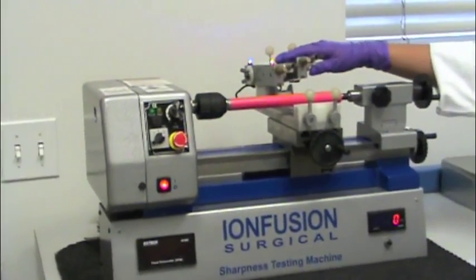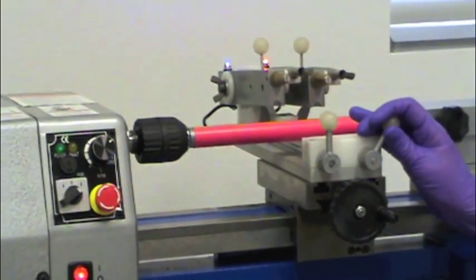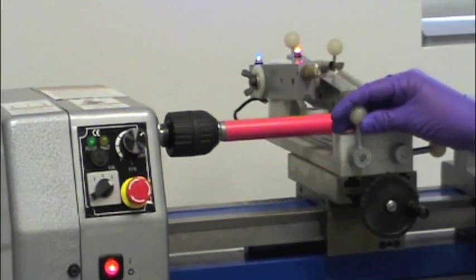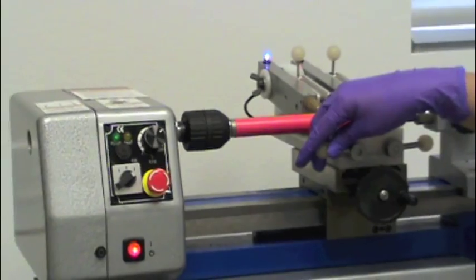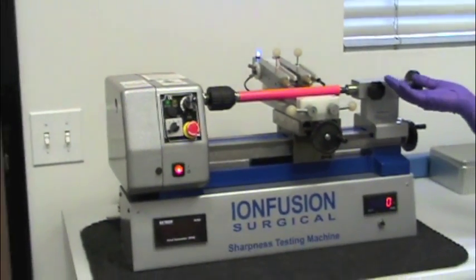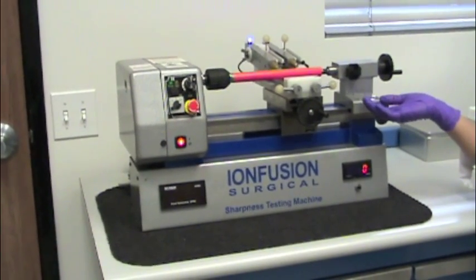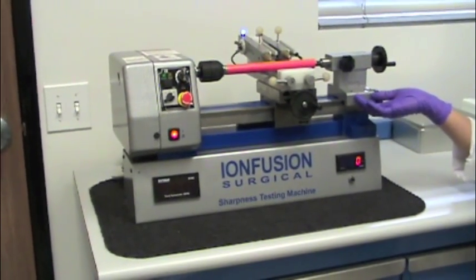The scalpel blade is loaded onto a weighted handle and rested gently on the test media. The test media is a tough type of vinyl material loaded on a steel shaft. When the machine is started, the shaft will start to rotate. When the blade cuts through the test media and contacts the shaft, the machine will stop, indicating the blade has cut through the material.